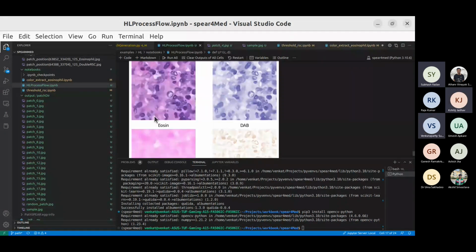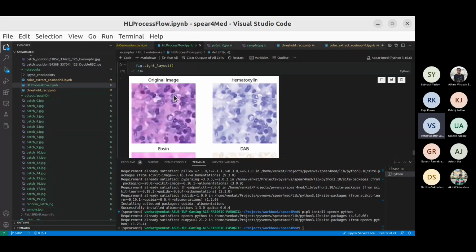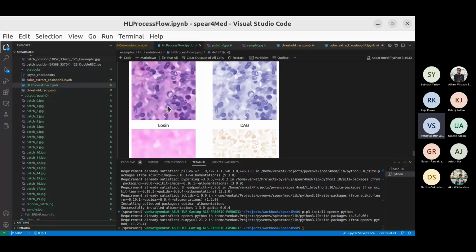Yes. So, Dr. Subhash, I wanted to show this part alone. This is where it can be HNE or CD, any of the CD series. What we have done is segregated based on the stain color, and we'll apply the templates for all of these four. So either H or E or the CD8, which is brown, we are confident that we can apply those templates.